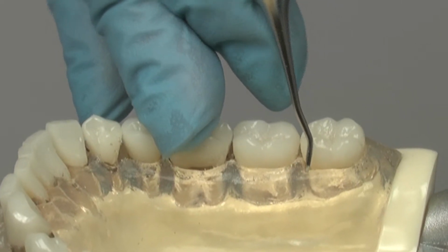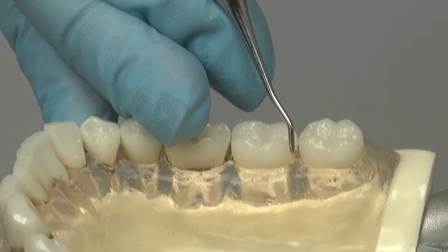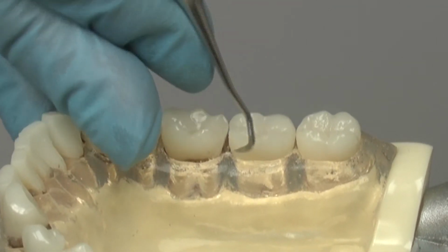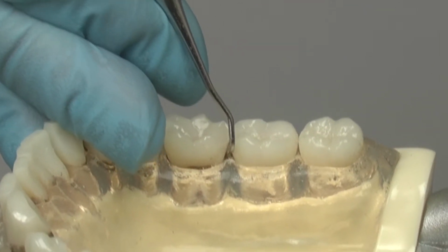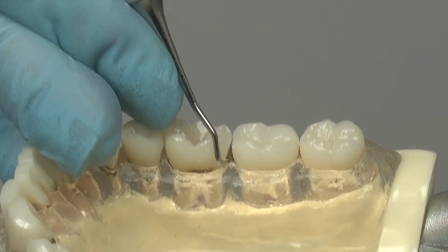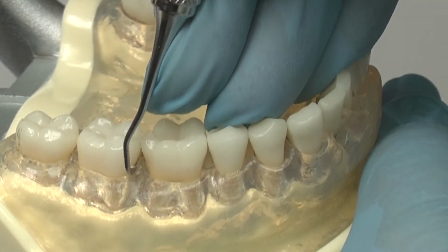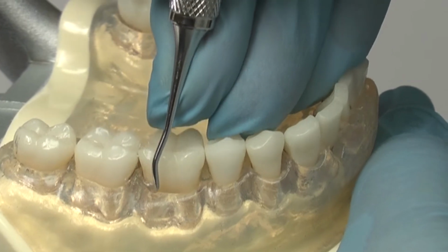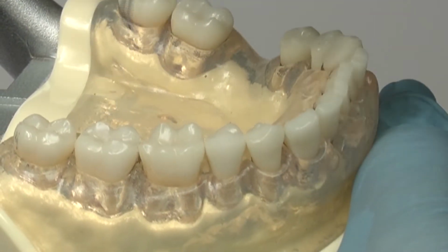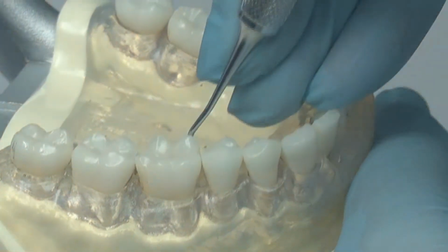The face of the blade is applied at 0 to 20 degrees and open to a 75 to 80 degree angle to the tooth surface. The instrument strokes are activated at the line angle with the tip toward the proximal surface. The stroke is completed on the proximal surface before moving to the adjacent tooth. The most efficient way to complete a scaling procedure on a selected section is to scale all proximal surfaces on the buccal aspect and then apply the opposite working end to complete the same process on the lingual side.